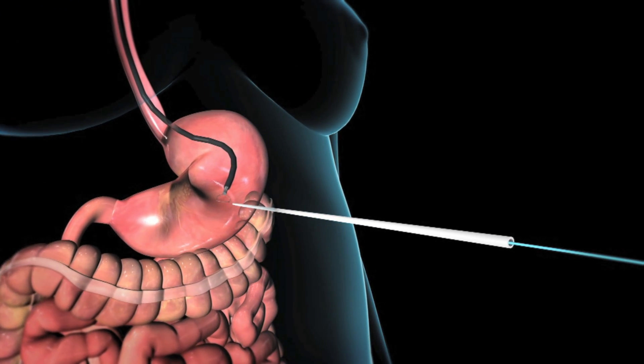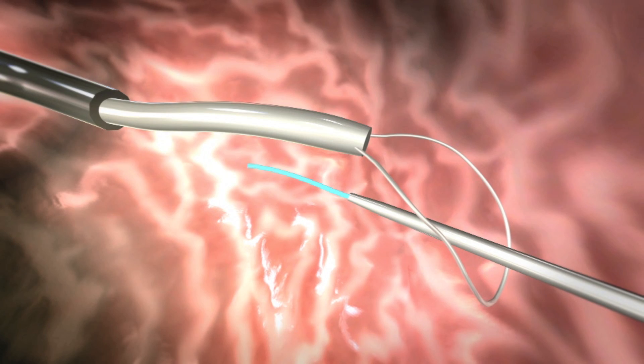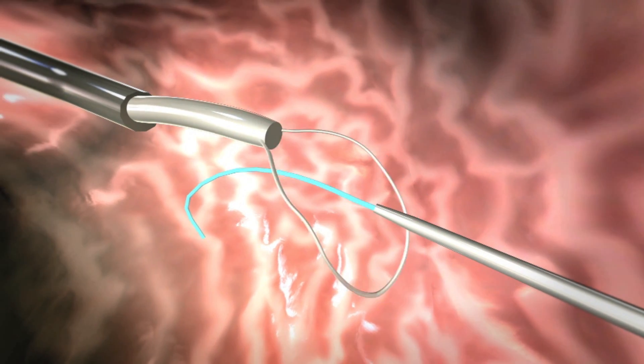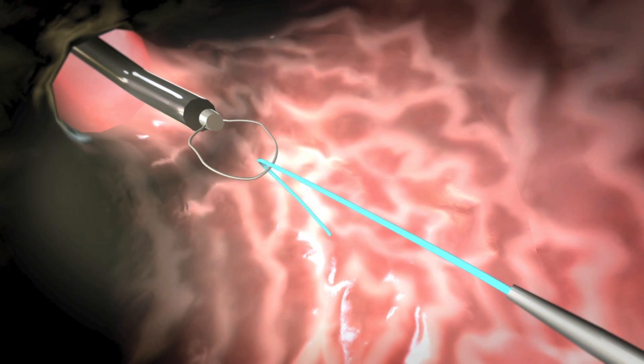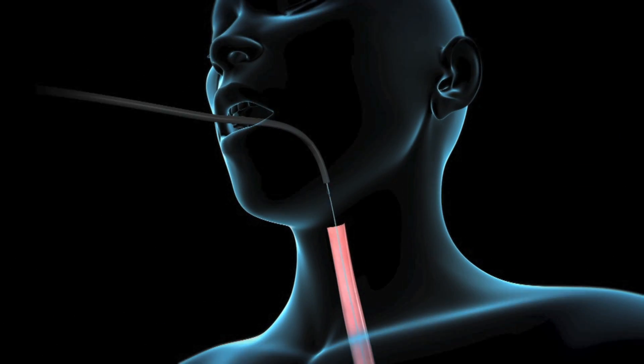Your doctor will then pass a thin wire through this needle into your stomach, grasp the wire with the snare, and pull both the endoscope and wire out through your mouth.